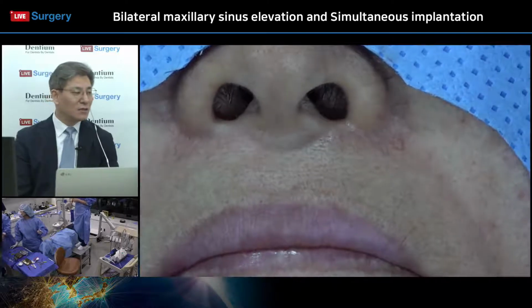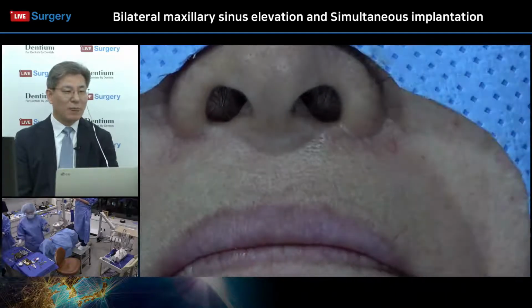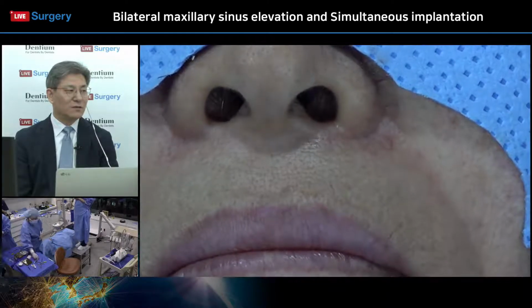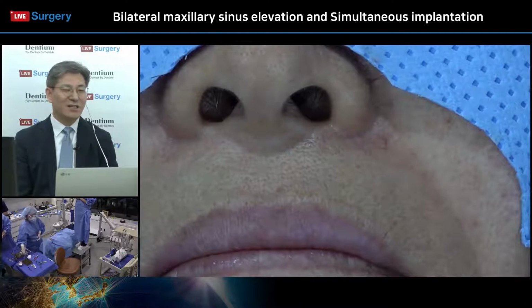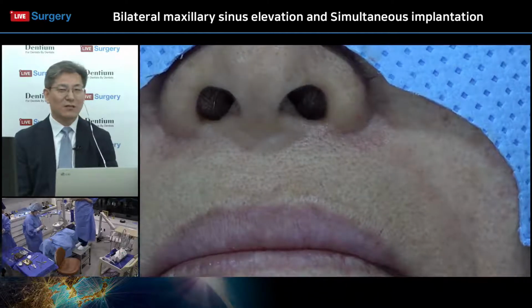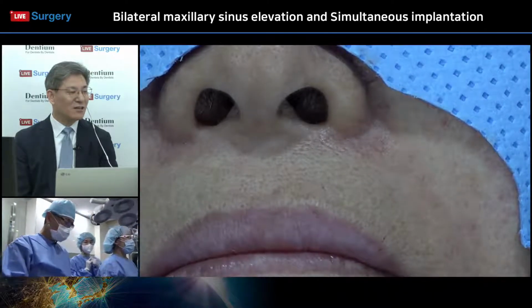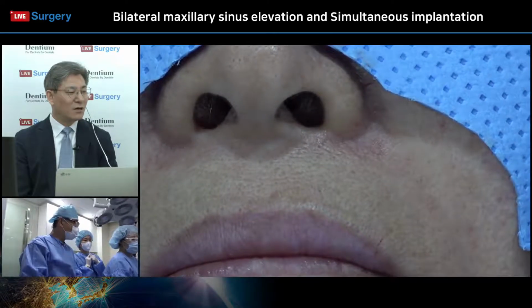Catherine, with the GBR, what do you think about doing the bite tray impression some days later for the stabilization? Today I will try to show how to do the bite tray impression and the scanning, but with the GBR the flap stabilization is important. I think the bite tray impression today is no problem, actually, Dr. Zhang, because you already got higher initial stability. Even though it is a GBR procedure, you already got a high insertion torque, so the bite tray registration is fine.